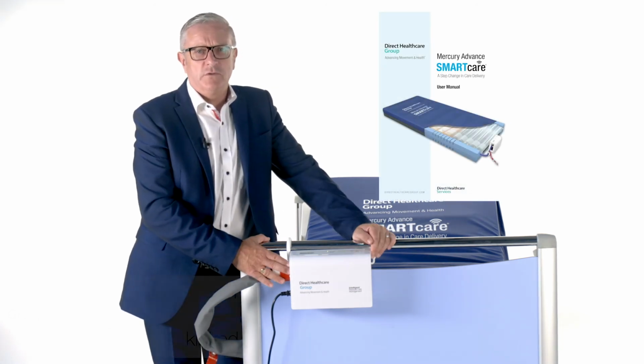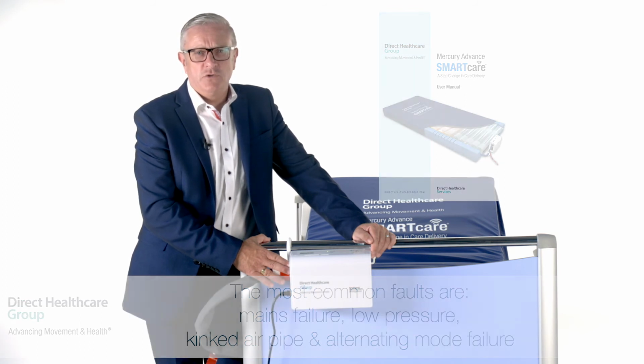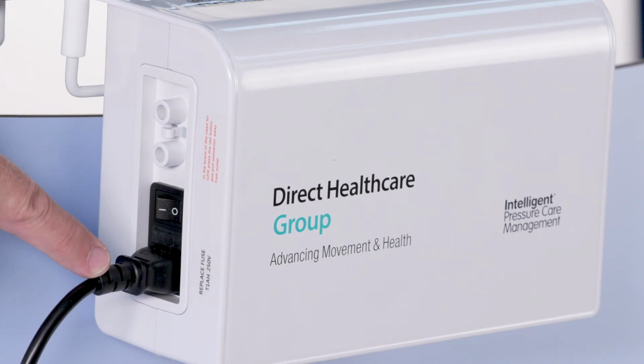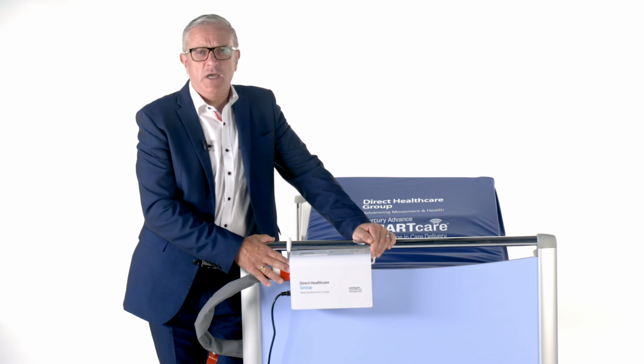However, the most common faults are mains failure, low pressure, air pipe kinked, alternating mode failure. If a mains failure should occur, the pump will give out an audible warning and the letter C will illuminate on the pump. The most common causes of mains failure are the mains lead being removed from the pump or the pump being switched off at the mains plug. Both of these should be checked to enable the issue to be rectified.